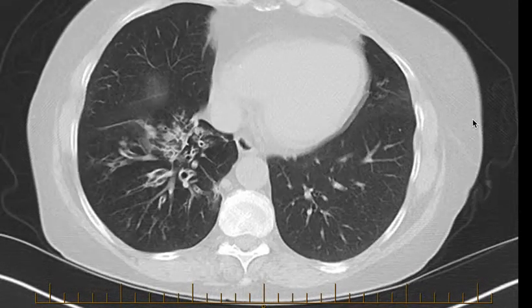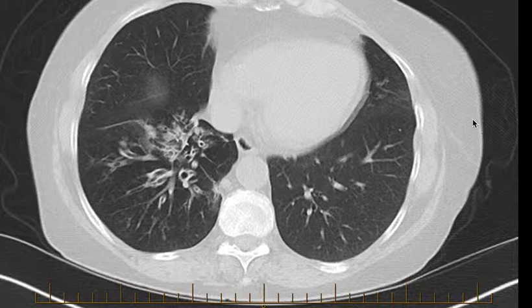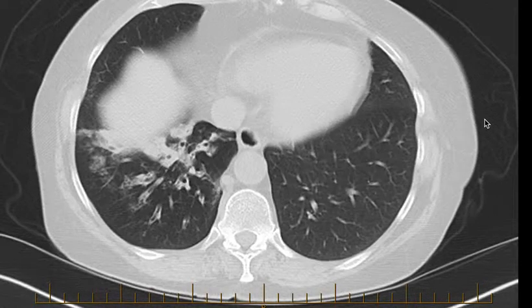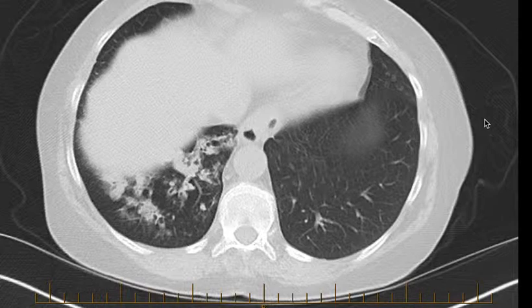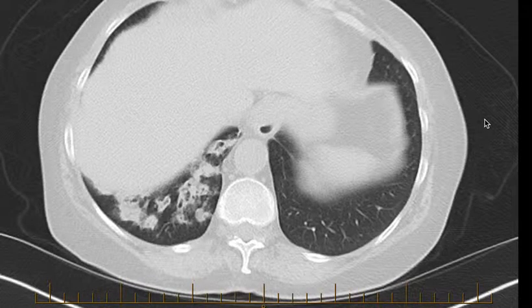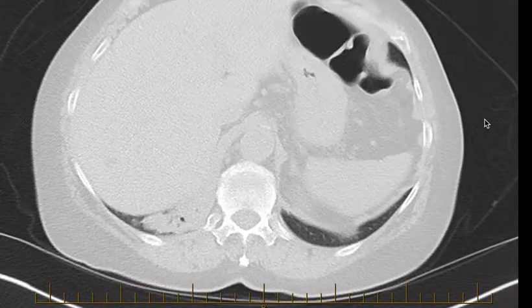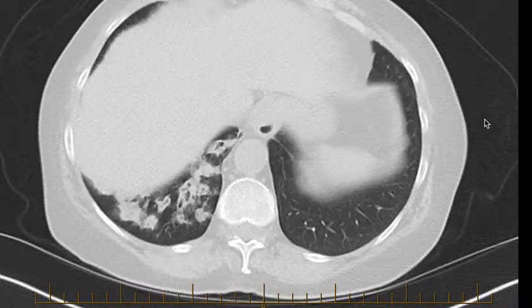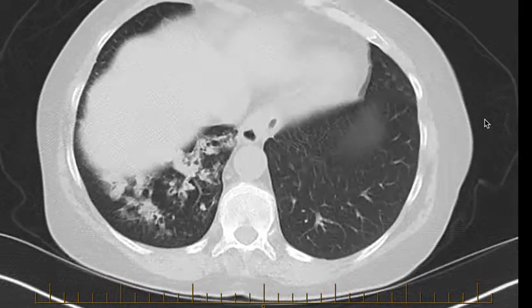As we're coming into the lower lobes here, we can see on the right hand side there's significant difference to the left, where there's bronchiectasis with bronchial wall thickening and dilatation of the bronchi, with some dense consolidation in that lower lobe right down the base of the right lung, with probably some mucus impaction as well as consolidation.